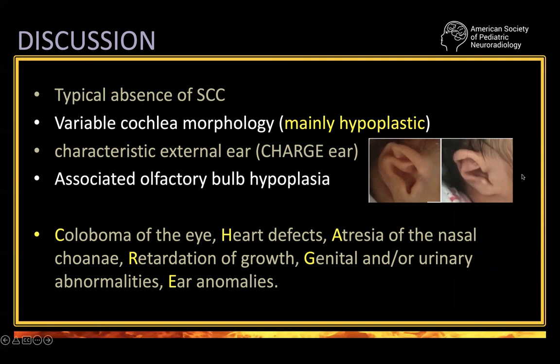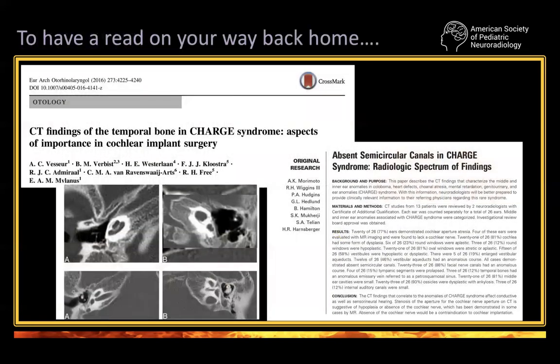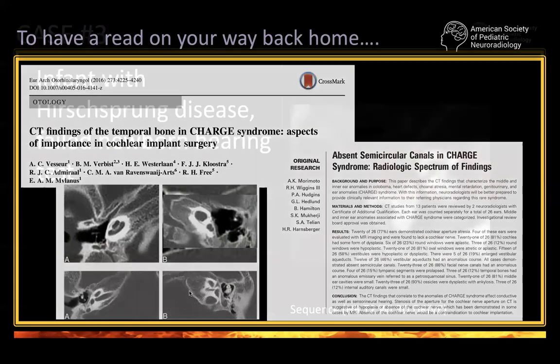CHARGE also has a characteristic external ear — the so-called CHARGE ear. Olfactory bulb hypoplasia was often overlooked in the past, but it seems to be very, very important. Remember: CHARGE stands for coloboma, heart defect, atresia choanae, retardation of growth, genital and urinary abnormalities, and ear abnormalities. When you don't see semicircular canals at all, look at the external ear of the child — the pinna — and think CHARGE. You can see the small cysts instead of the vestibule without semicircular canals, typical of CHARGE.